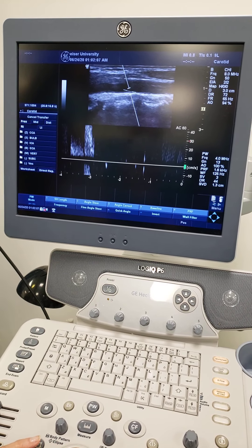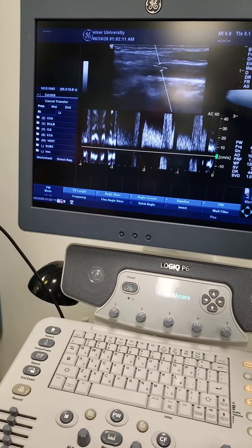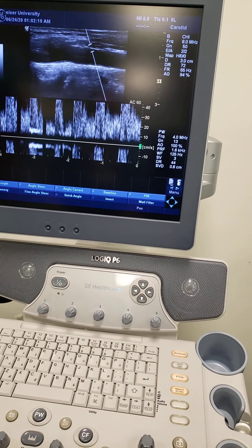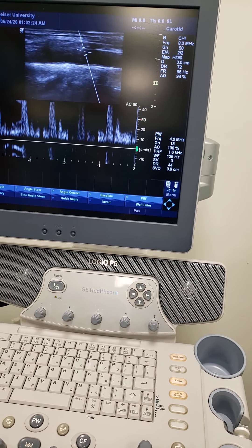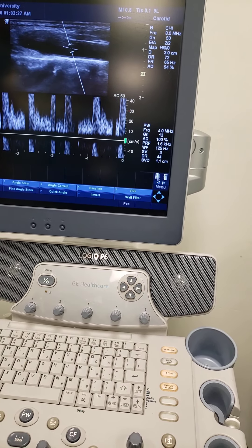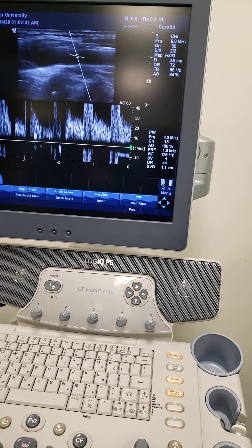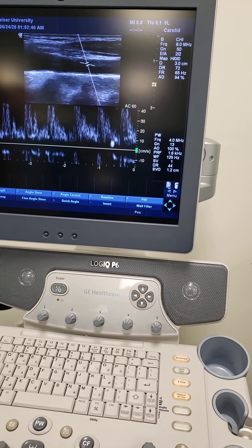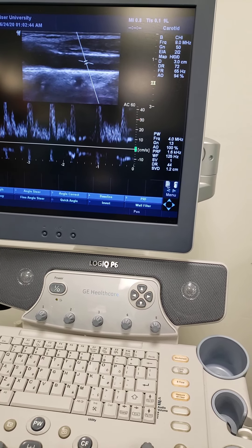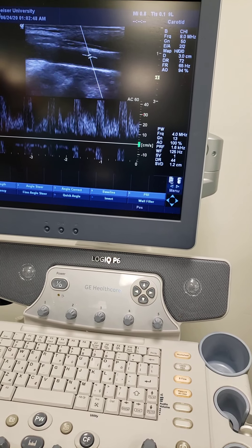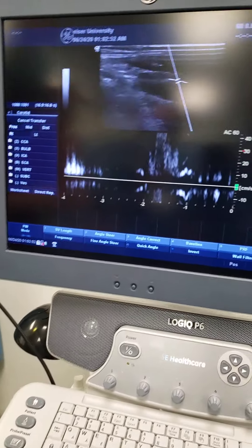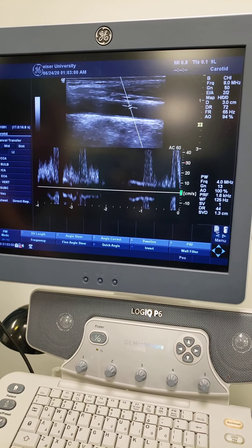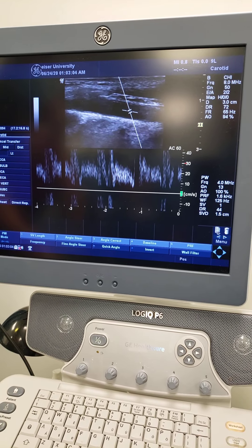How do you know when you're at 60? Does it tell you? Well, it says 60, but I have to line it up. She's got to move the hands too, because you lined it up with the wall. Do you see that? Does it move on its own, this little thingy? The cursor? You have to line it up with the wall. But the wall isn't at 60 — see how it's not lined up? I have to do this. See when I do this on my neck? See how it changes? I have to make that line up. Then when we do that, we bring it in, and we know what's happening.